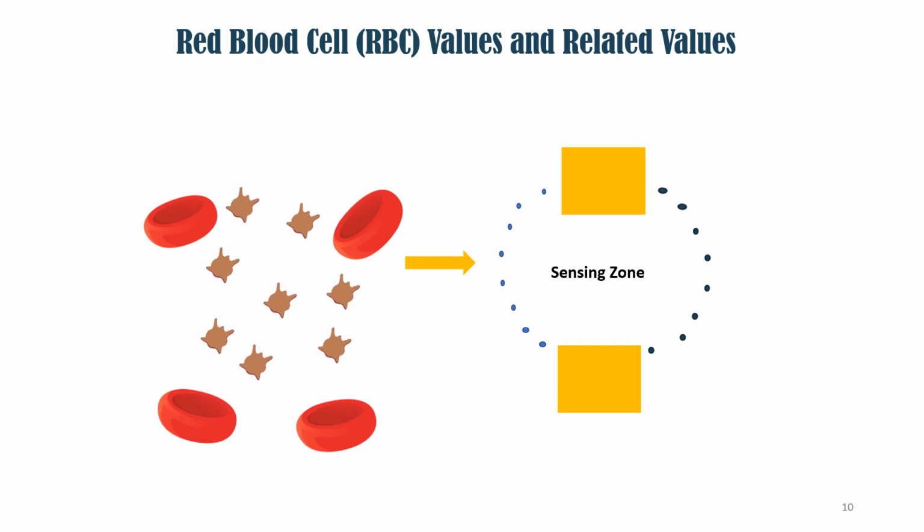Therefore, if you don't follow protocols and these small platelets attach one to another, the machine, instead of calling it platelets, will call it red blood cells. If the red blood cells are activated and clumped together, these sensors will not call this clumping of red blood cells by itself, but they will perhaps call it a white blood cell. Because once again, the machine does not know how to recognize white blood cells, red blood cells, and platelets. It can only measure the size.